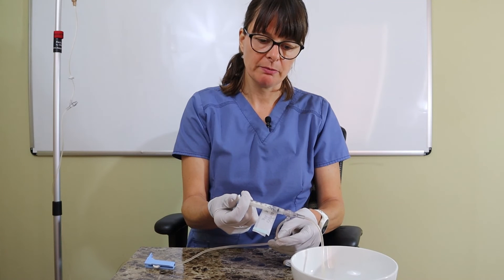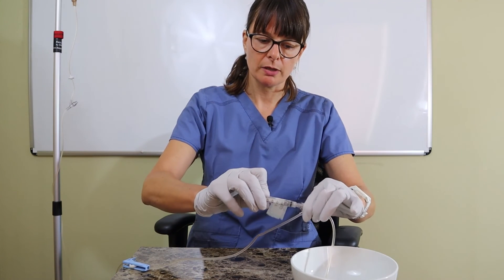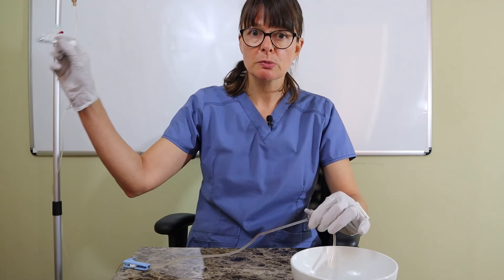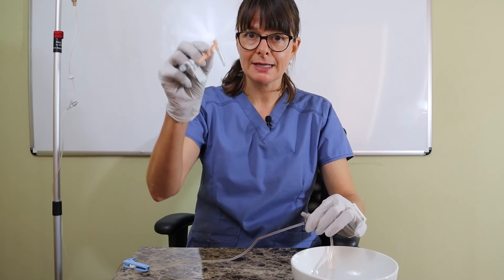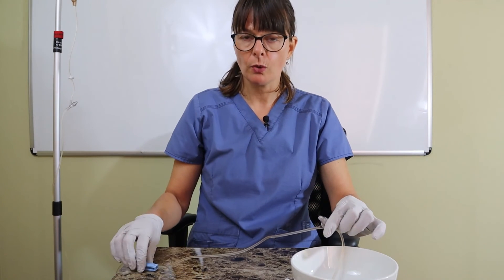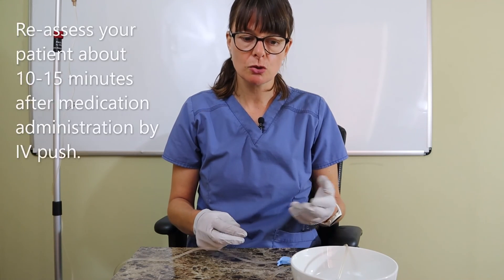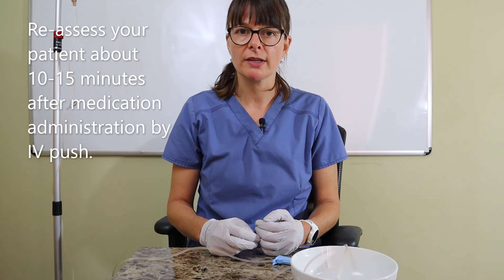Once I'm done administering the medication, I can unhook my syringe and dispose of it as well as the needle appropriately in the sharps container. Then I'll go ahead and document the medication administration, and check back on the patient in about 15 minutes to see what effect the medication has taken and to make sure that they don't have any adverse reactions.